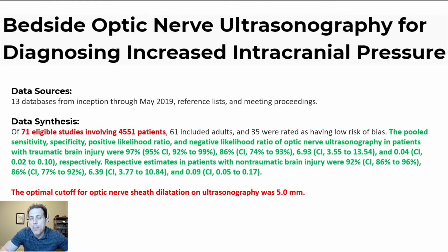So this first paper here is Bedside Optic Nerve Ultrasonography for Diagnosing Increased Intracranial Pressure. And this is a meta-analysis. Here we looked at 71 studies involving 4,500 patients.